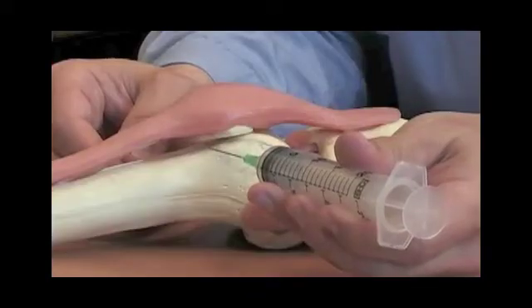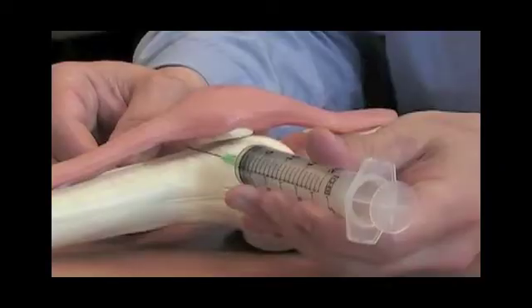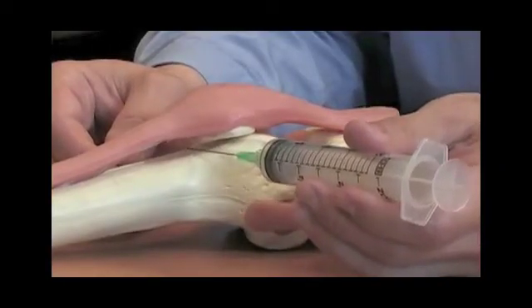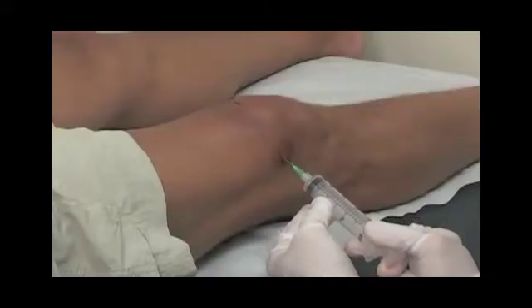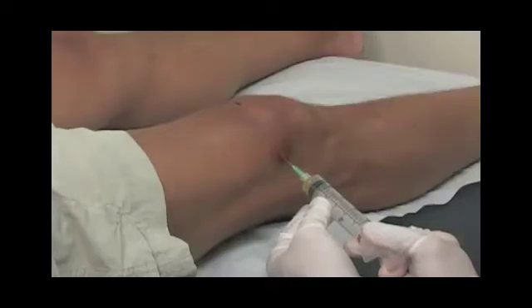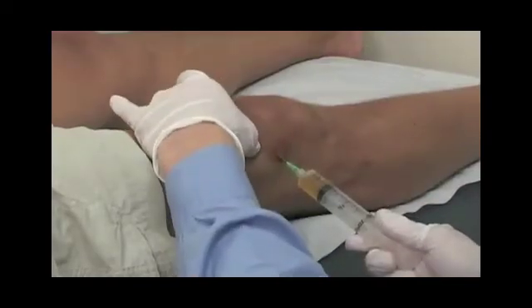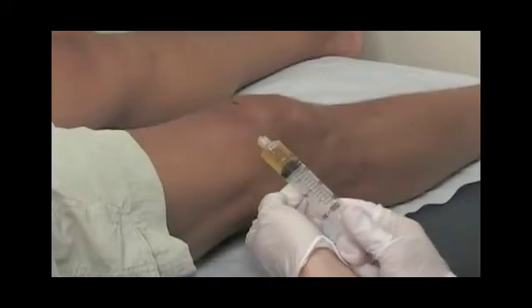I'll then take a needle on a syringe and place it right through that same exact area, penetrating the capsule of the knee joint. I'll attempt to aspirate fluid. If fluid is attained, we'll withdraw that syringe. If we're unable to achieve aspiration of fluid from the knee joint, we'll redirect the needle and re-attempt. Once fluid is aspirated, or simply a flashback of fluid within the barrel of the needle, we proceed.